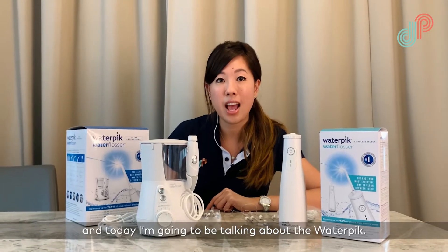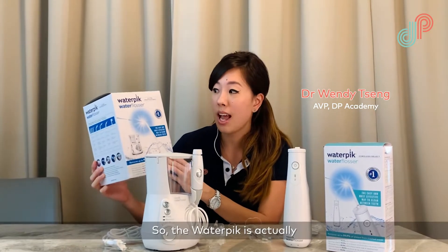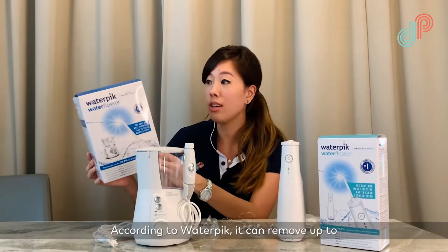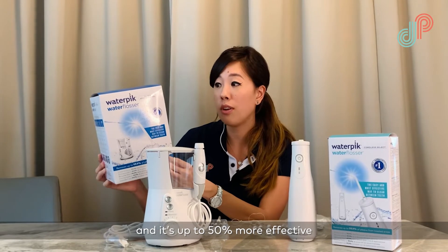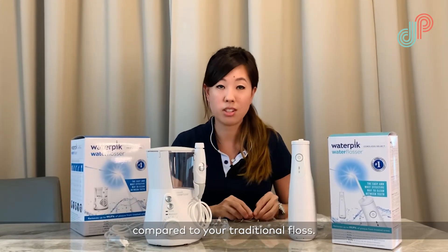Hi, I'm Dr. Wendy and today I'm going to be talking about the Waterpik. The Waterpik is actually the number one water flosser brand in the world. It's clinically approved by the American Dental Association and according to Waterpik it can remove up to 99.9% of plaque from treated areas and it's up to 50% more effective for improving gum health compared to your traditional floss.